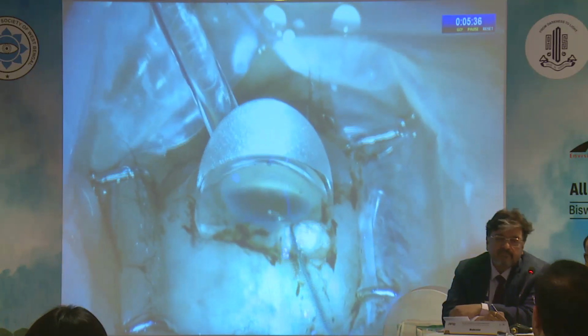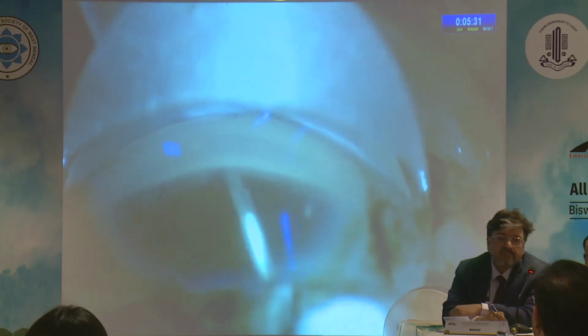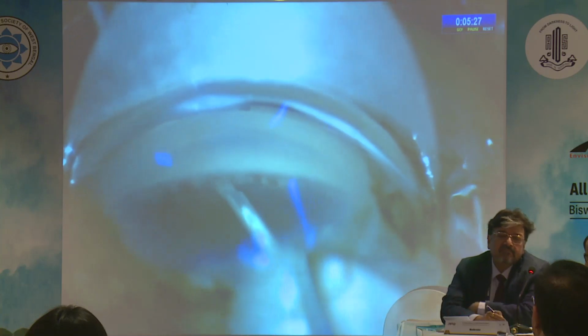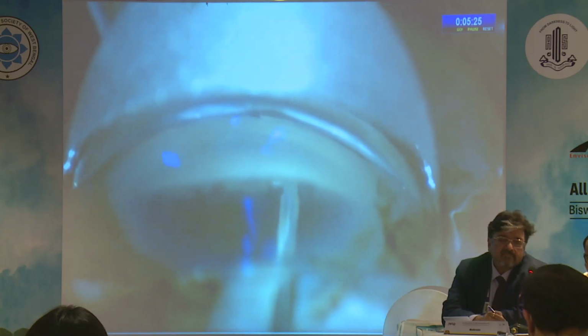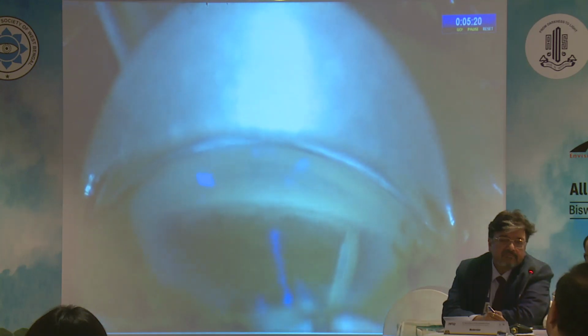The blade's sharp tip is carefully guided through the nasal trabecular meshwork against the wall of Schlemm canal. The dual parallel blades create paired parallel incisions in the trabecular meshwork by rotating either clockwise or counterclockwise for about 3 to 5 clock hours, depending on the surgeon's preference.